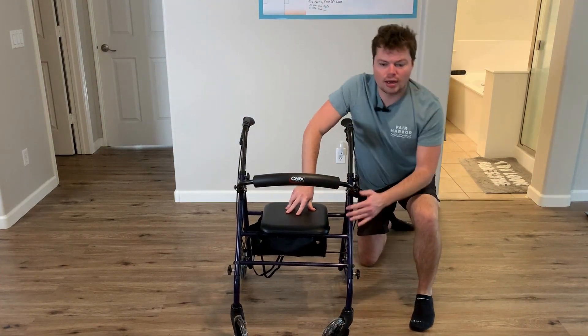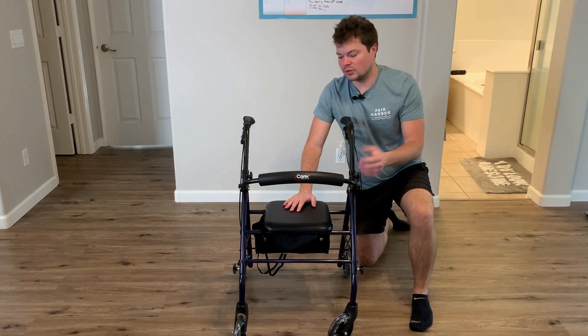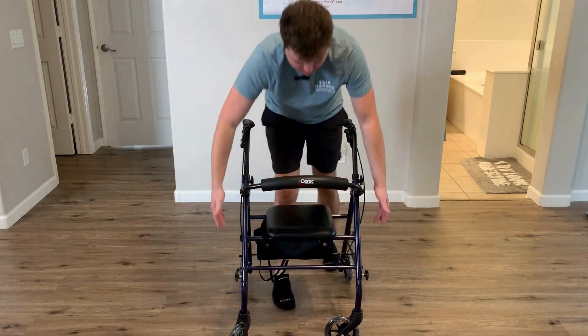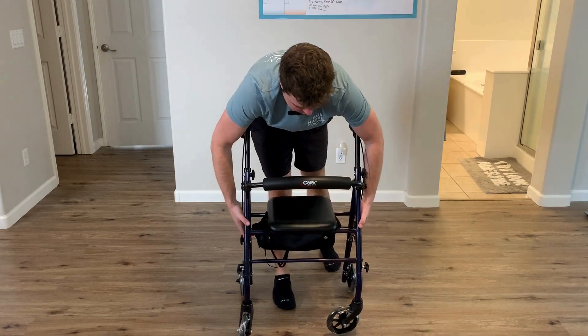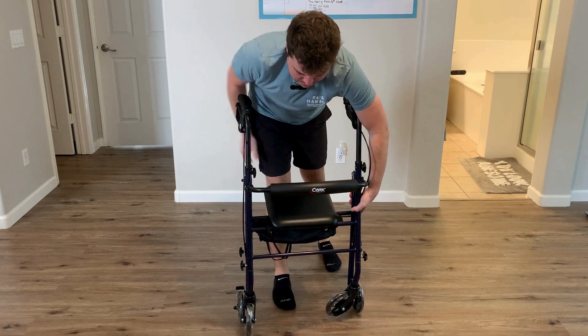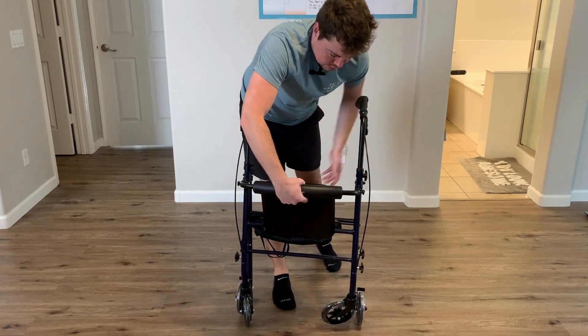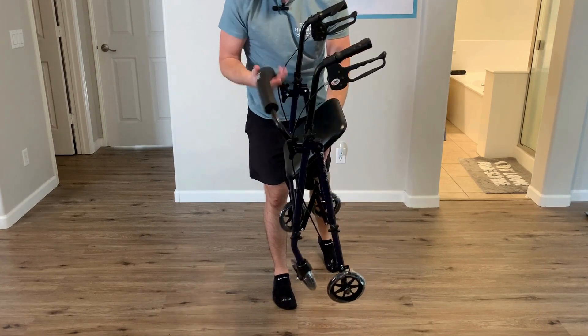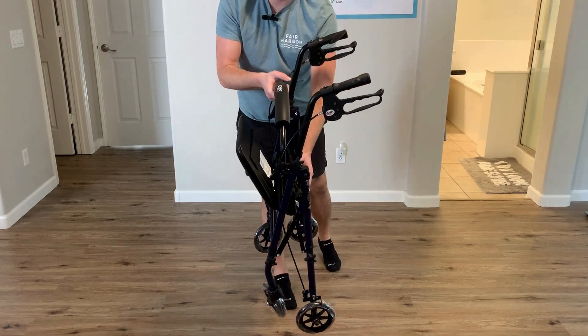Now onto the final question: can you fold this up to travel? Yes, they make it really easy to fold it up. All you've got to do is just grab this down here and it'll slide together. You can flip your seat up and you're good to go. Watch out for the seat, and that's what it looks like folded.